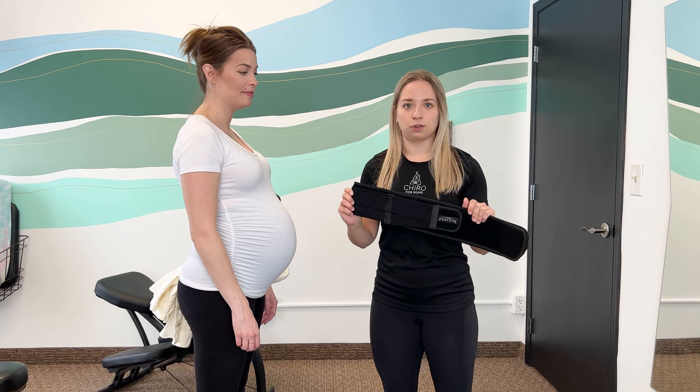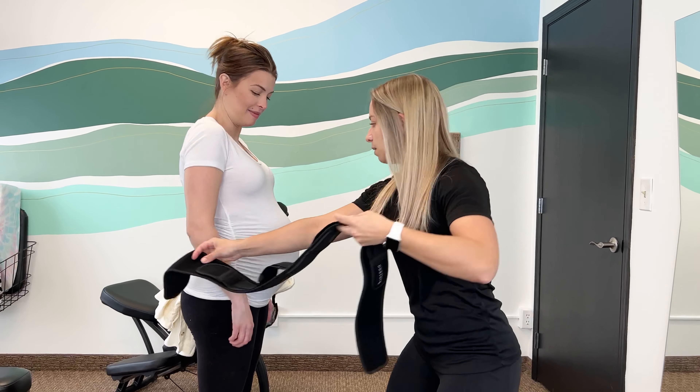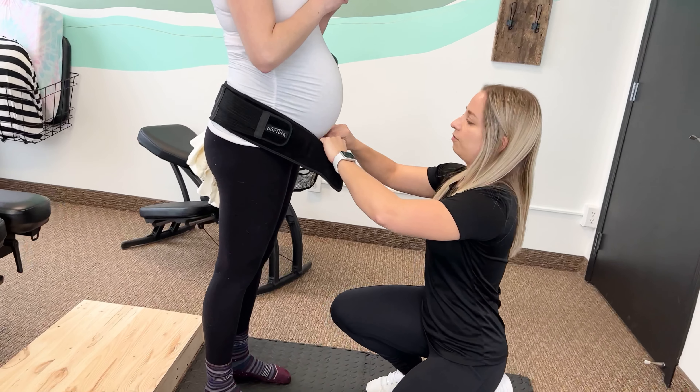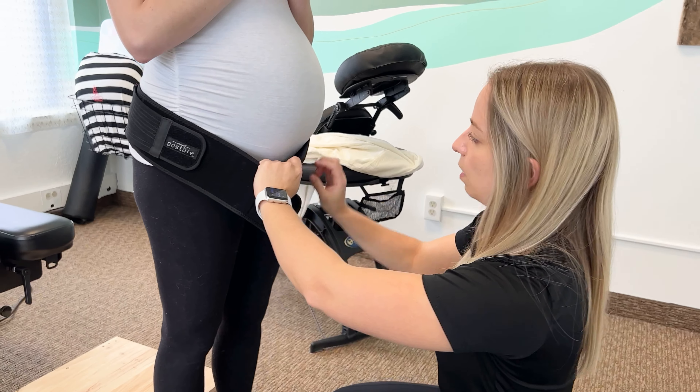Here we're going to demonstrate how to wear a belly band or SI belt — our lumbosacral support belt. So we've got our beautiful mama here. I'm going to have you grab that with your left hand. The biggest thing with this is I want you guys to wear it low. It's going to wrap around the front and it's going to be underbelly. You want to take the pressure off the belly from the pubic bone as well as those hip flexors.